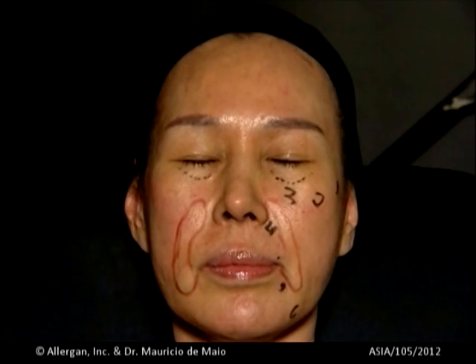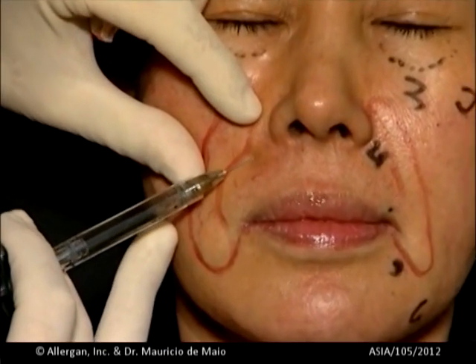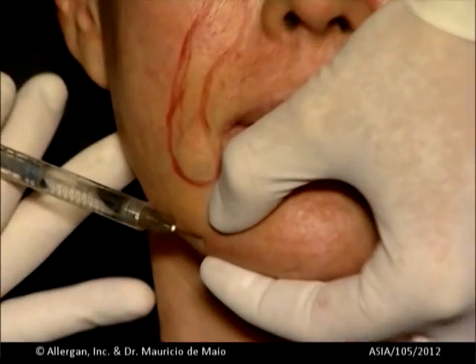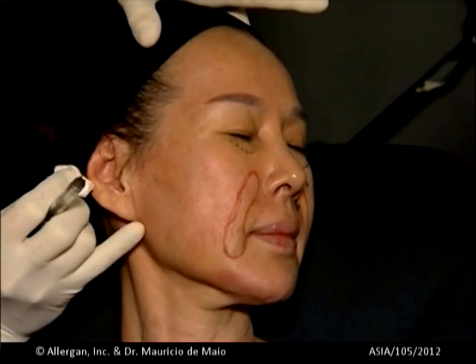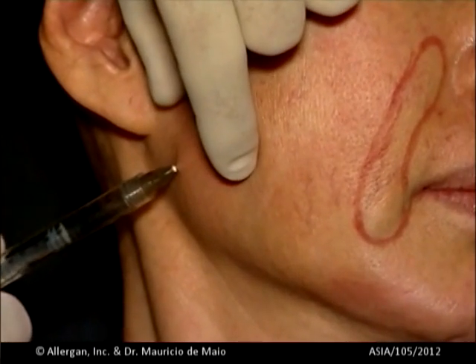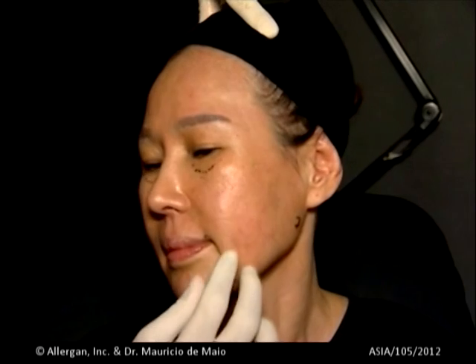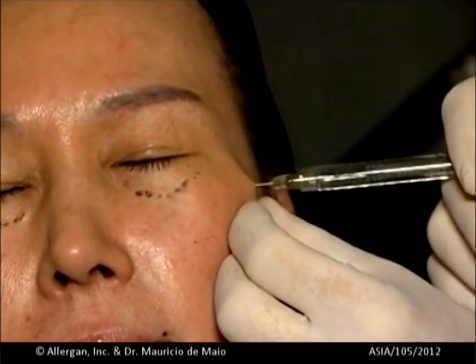In this patient, I skipped point 3 and proceeded directly to point 4, changing to Ultra Plus in the nasolabial fold. Skipped point number 5 and went back to Voluma in the pre-jowl sulcus. Now, point 7, bolus in the subcutaneous, clean, and we evaluate that there is already improvement at the marionette lines in this patient. The same is carried out on the left side.